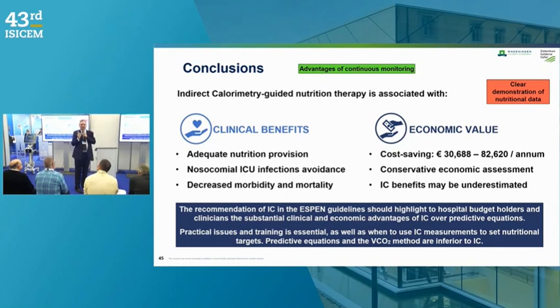So first I check, could it be in this patient? So were the previous readings also very high, like 4,500? Then it could be true. But when it was like 1,500, 5,000, you have to check, is that really a good measurement? Because there can be some technical issues. That's also important to follow your gut feeling, if it's okay.